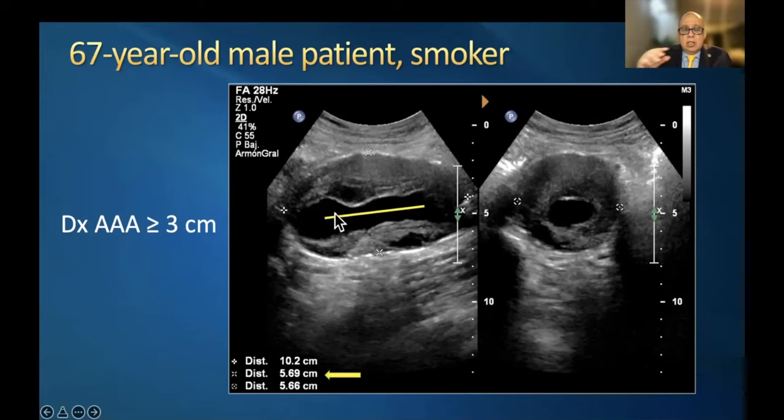I recommend to trace a line. You can do it over the image or you can do it in your mind. Make a trace with the long axis in this case. And then we have the line representing the beam of ultrasound. And here is the place to make the measurement. It's a perfect cross with 90 degrees. So it's a perpendicular position of the beam and also of the calipers.